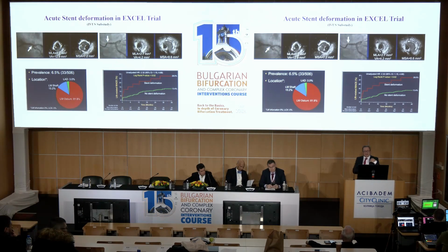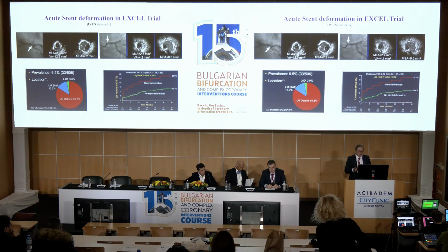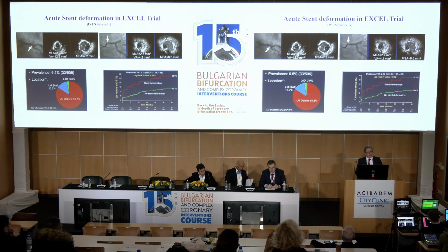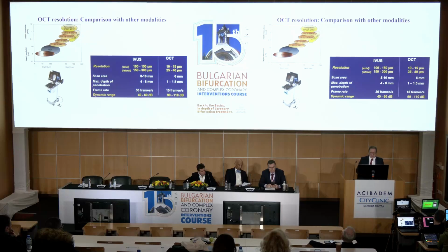So the outcome of these patients is very bad. Therefore, we have to assess the final results not only based on angio, because it's not well visible, but it can be relatively well corrected, knowing about this complication.